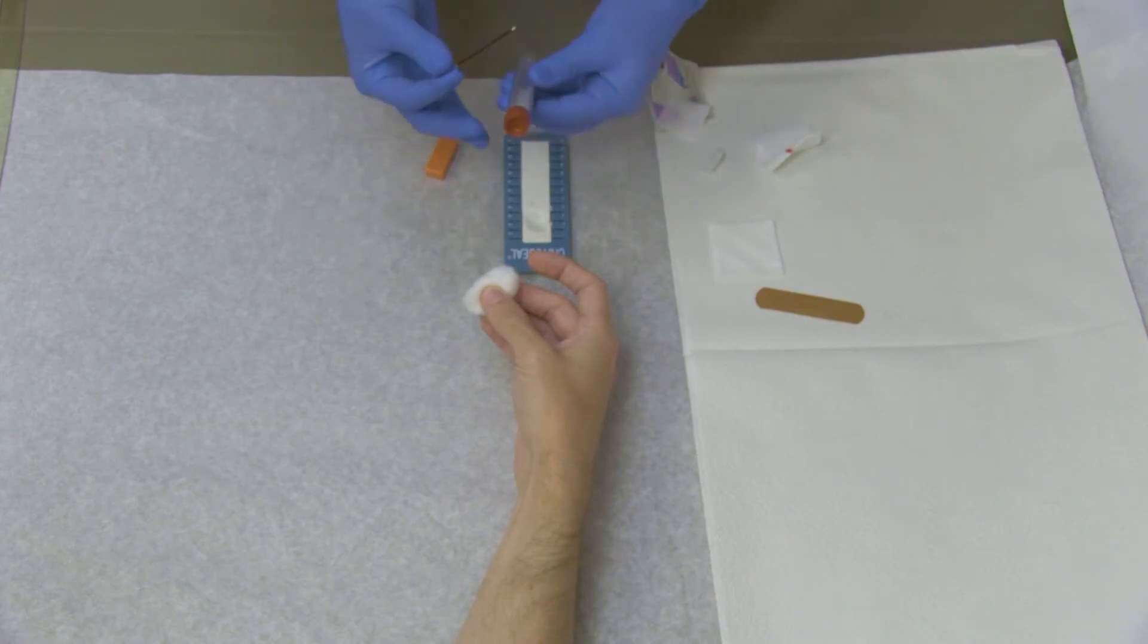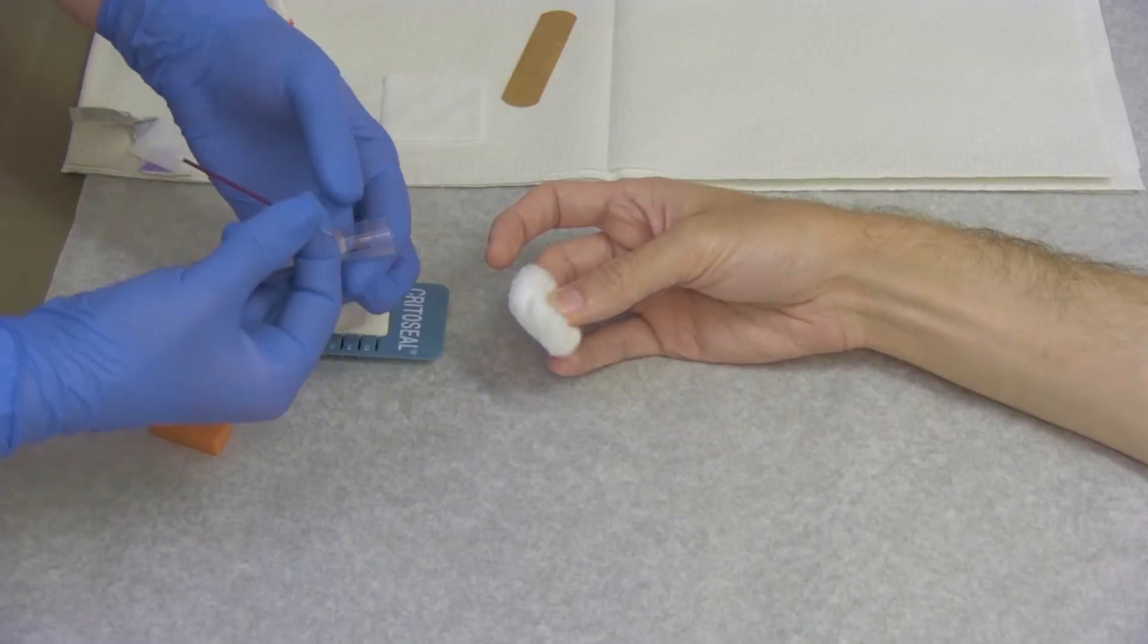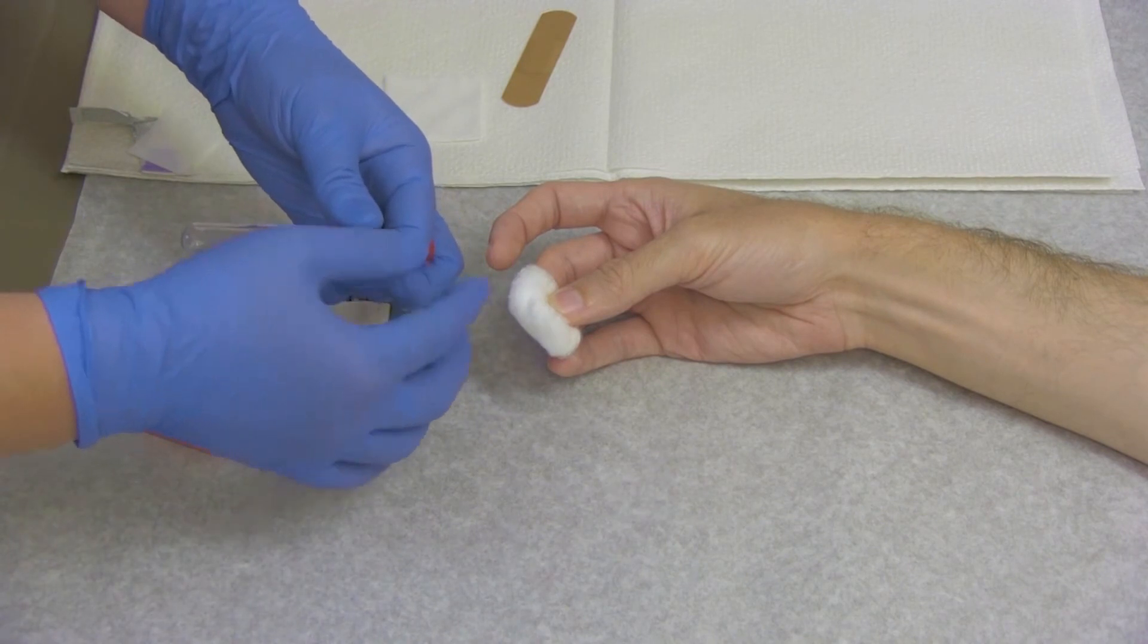Dispose of gauze and cotton balls, gloves, and mask in the biohazard container. Place the filled tubes into either the urine cup and screw the cap on, or the red tube and replace the red stopper. Then label the cup or the tube.